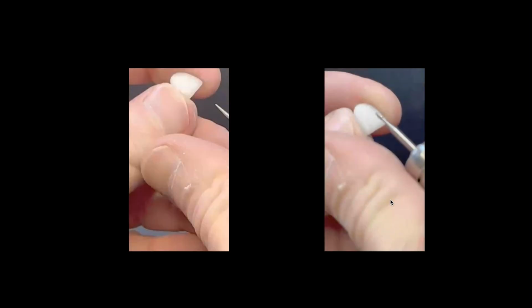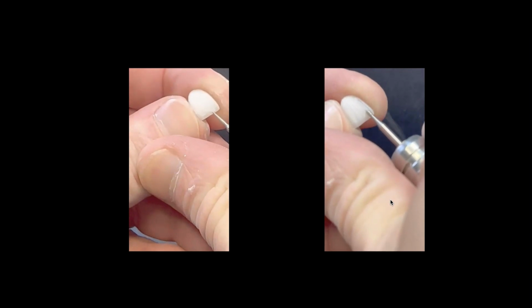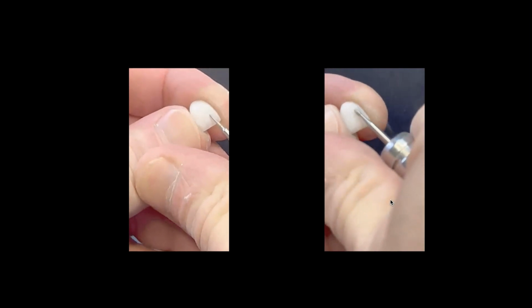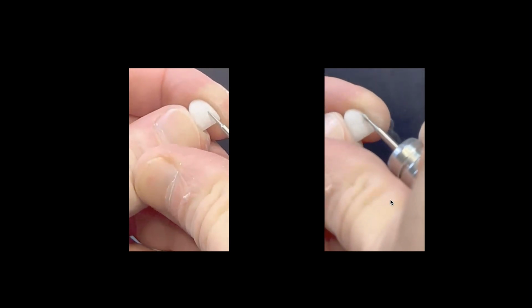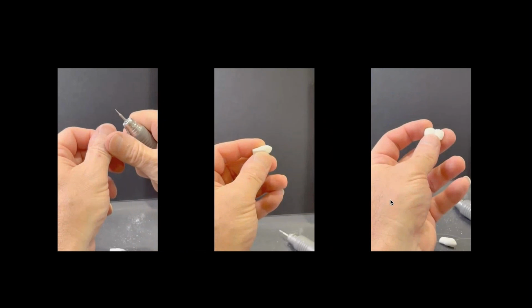I think I could play these. Yeah, I'll play them both at the same time just to save some time. Now you see I've changed one of the burrs on the left of the screen. I'm using much more of a point and getting into some of those grooves and ridges. And on the right side of the screen, I'm using more of a pear-shaped burr, roughing through the surface and maybe taking away some of the ridges and grooves that I put in and maybe adding some new ones, right? I think that's the beauty of having the differentials to make it look real: sometimes you have to put more in and take it away, either in the rubber wheel or the polish, to make it work.